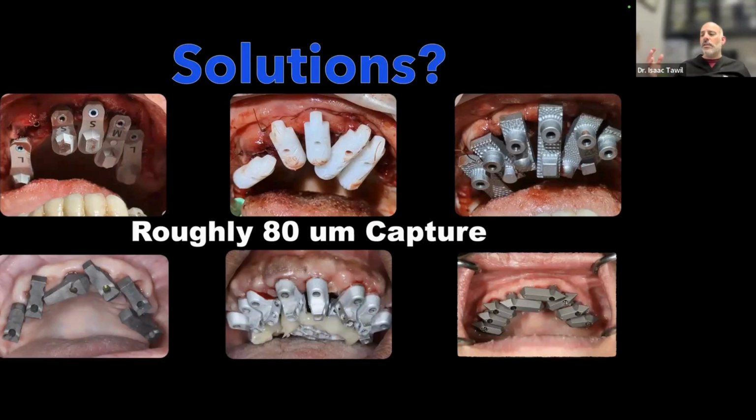The Nexus iOS. They haven't opened it up to a lot of labs because they know they're not perfect. It's hard for them to capture everything in that realm, and it's not the fault of the device. The device is fine. The Scan Ladder, Nexus, all of that, it's great stuff. The problem is that we only get a good amount of capture on it because the scanners can only be that good. And roughly, in my own studies and other papers you'll see, we can get to as good as about 80 microns worth of capture using these devices.